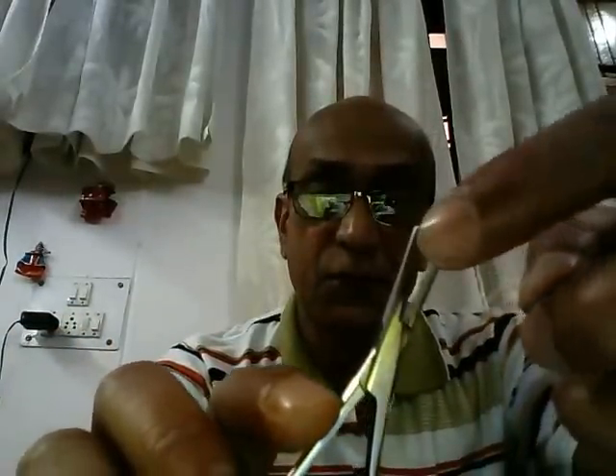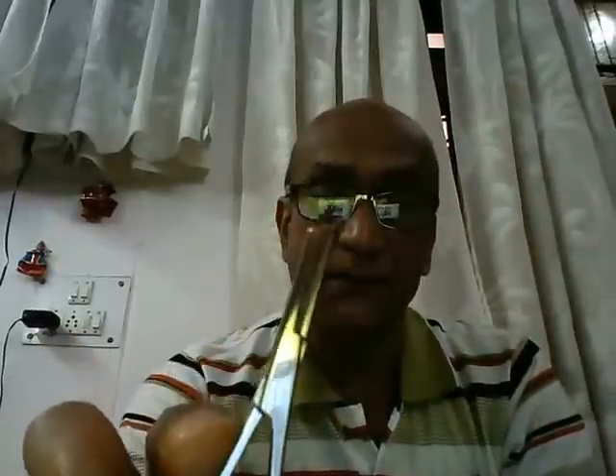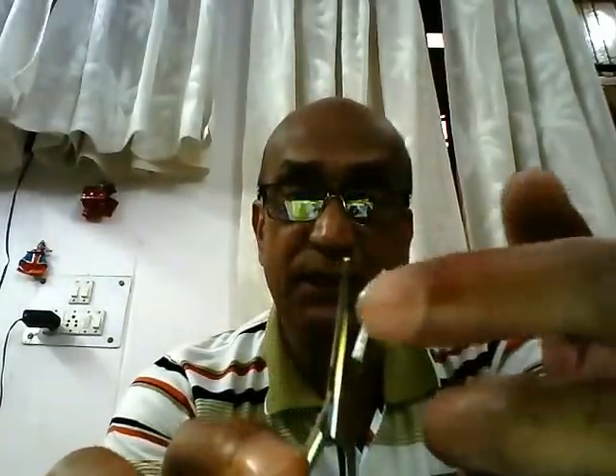Finally, we have the jaws. The jaws of an artery forcep differ from those of a needle holder — in a needle holder, the jaws are small and stout to hold the suturing needle, whereas here the jaws are longer and more slender. On the inside, you'll find a number of horizontal serrations. The straight artery forcep is used to hold tissues and stay sutures, and the serrations provide a firm grip.